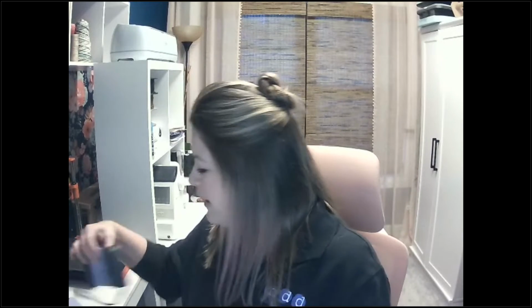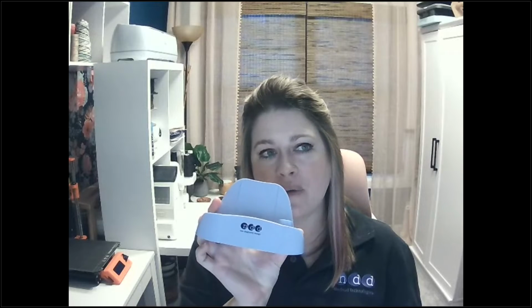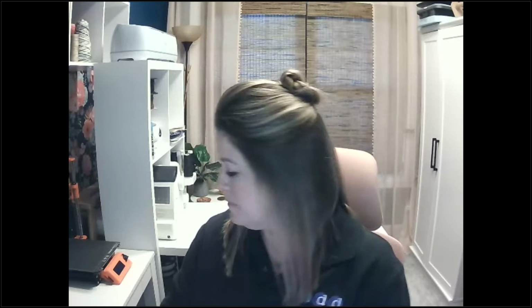Before we move into the actual test, we're going to talk about just some different supplies that we need to get started. So obviously we will need our EasyOne Air spirometer. This is the dock for the EasyOne Air. You'll notice in the back that there are two different ports. One is for the power to actually charge the device, and the other is where you can connect either directly to a printer or connect to your computer to utilize the EasyOne Connect software.